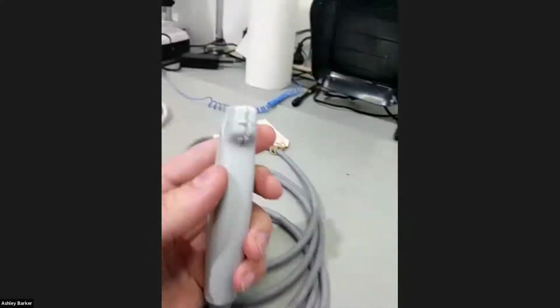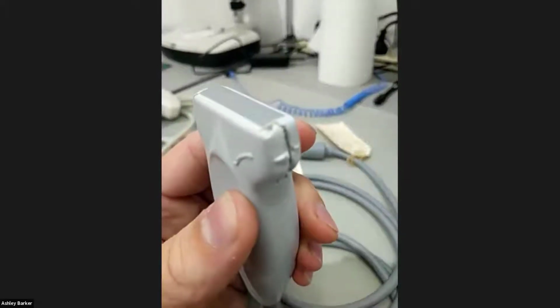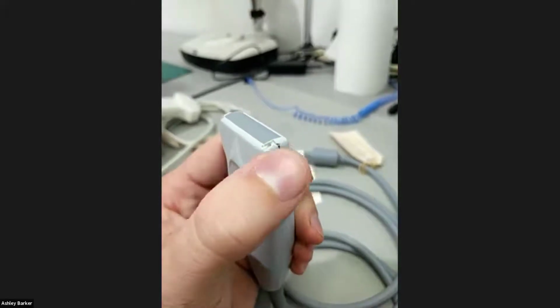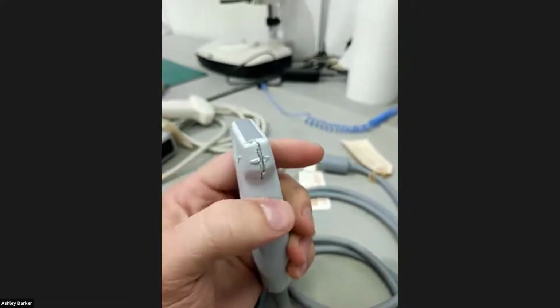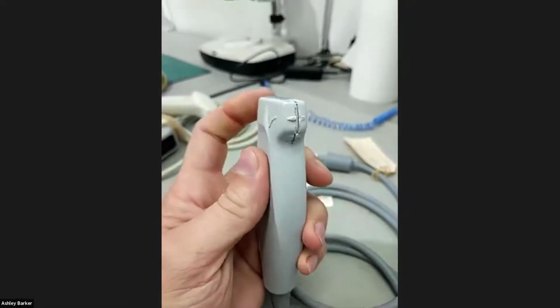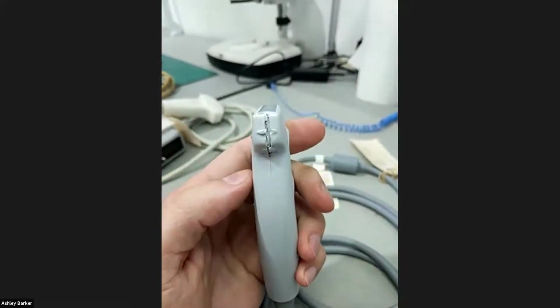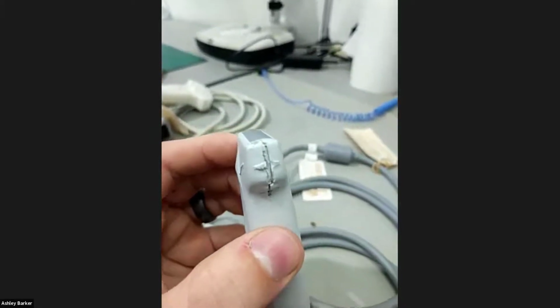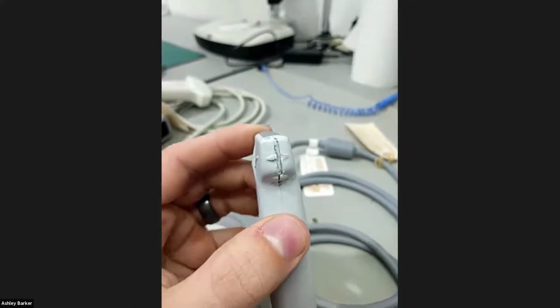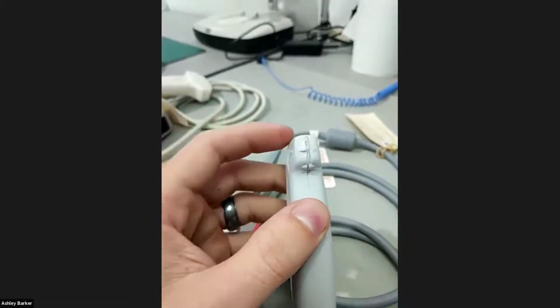Another really common thing we see moving down from the lenses is, hopefully you can see this, all the cracking that's happening there. It's a bit better a bit further away. Yeah, okay. So if you can see all that cracking that's occurring around there, and you get that on pretty much any brand of probe, if it's being dropped, it starts just cracking out the sides, and that is repairable, and definitely worth repairing, because again, if you get fluid in there, then it's going to get into all that electronics. And we've had probes in where we've popped the cases apart and there's just like a green, horrible sludge that pours out. It's disgusting. So yeah, if there's any form of hole, it's worth getting it plugged, basically.